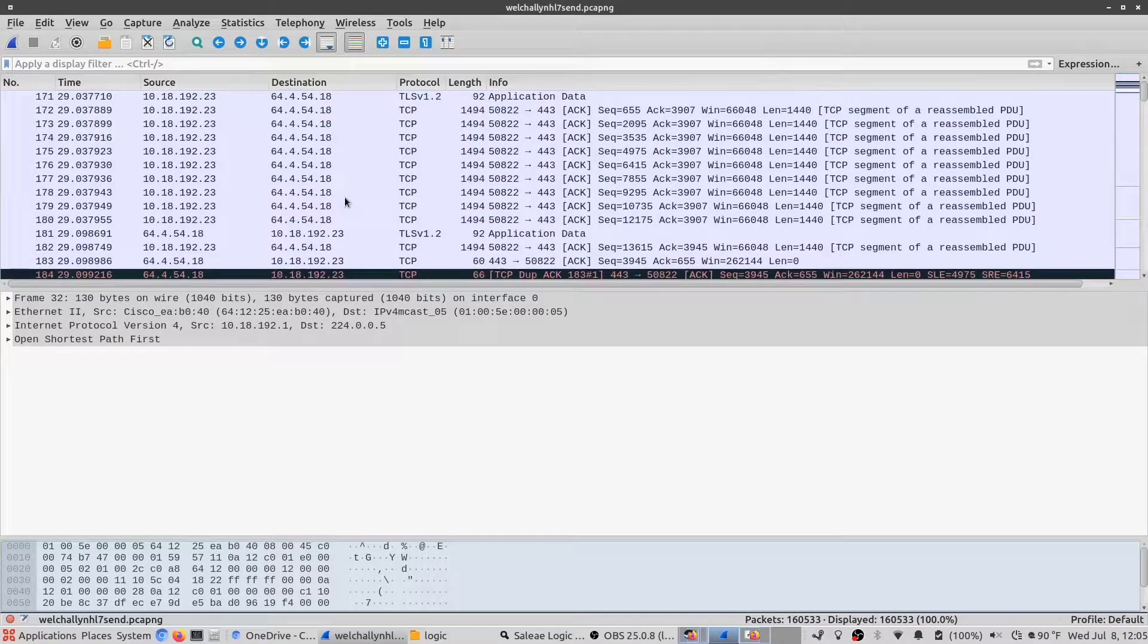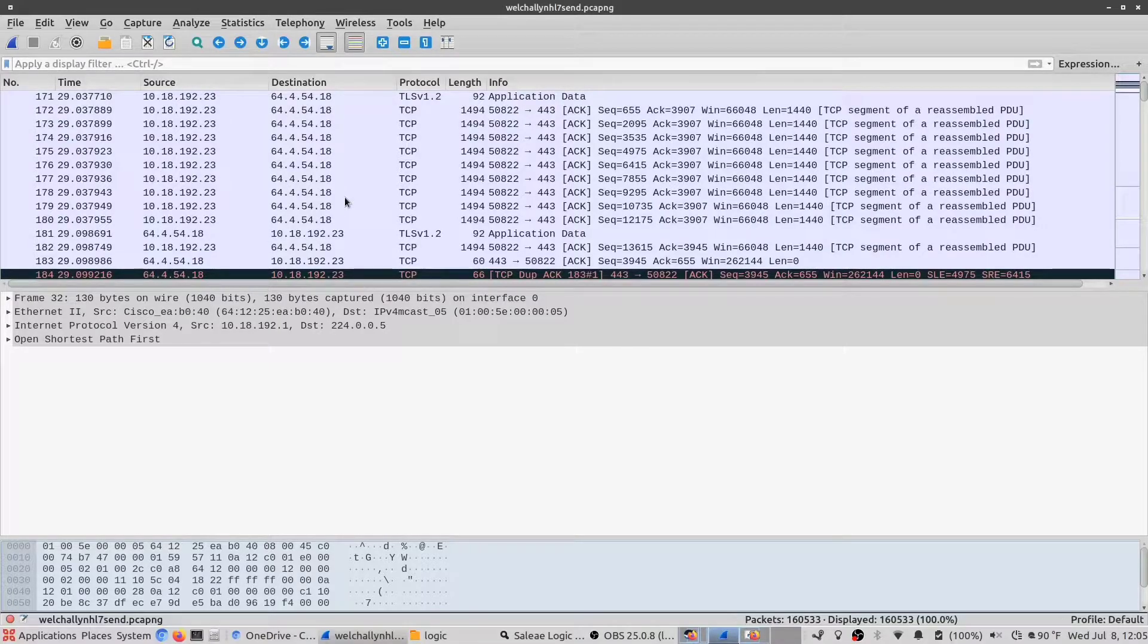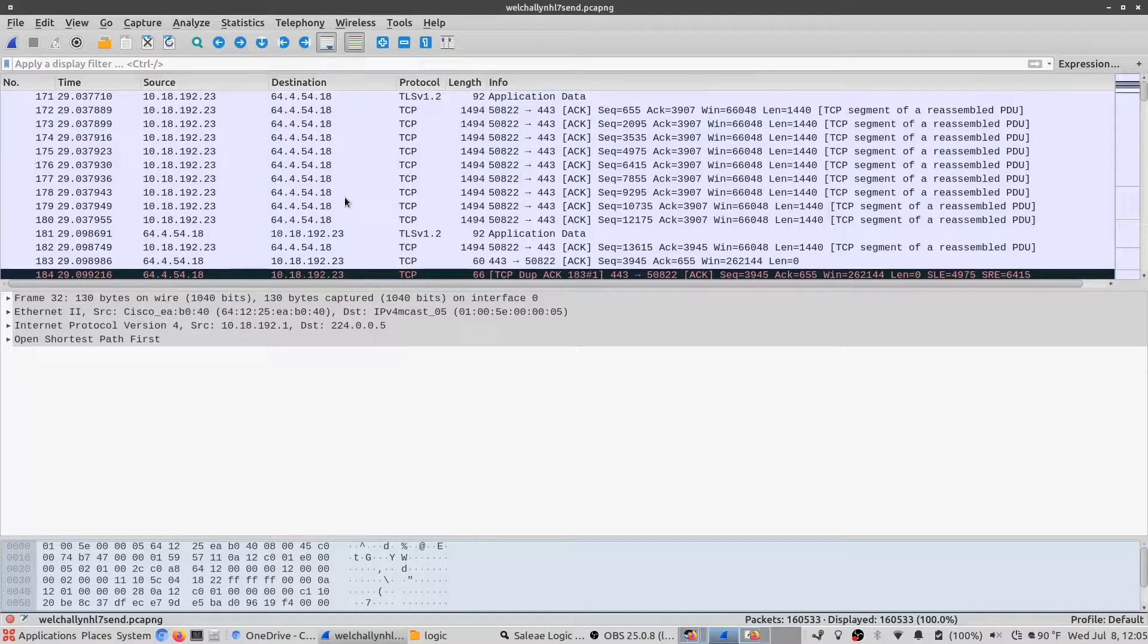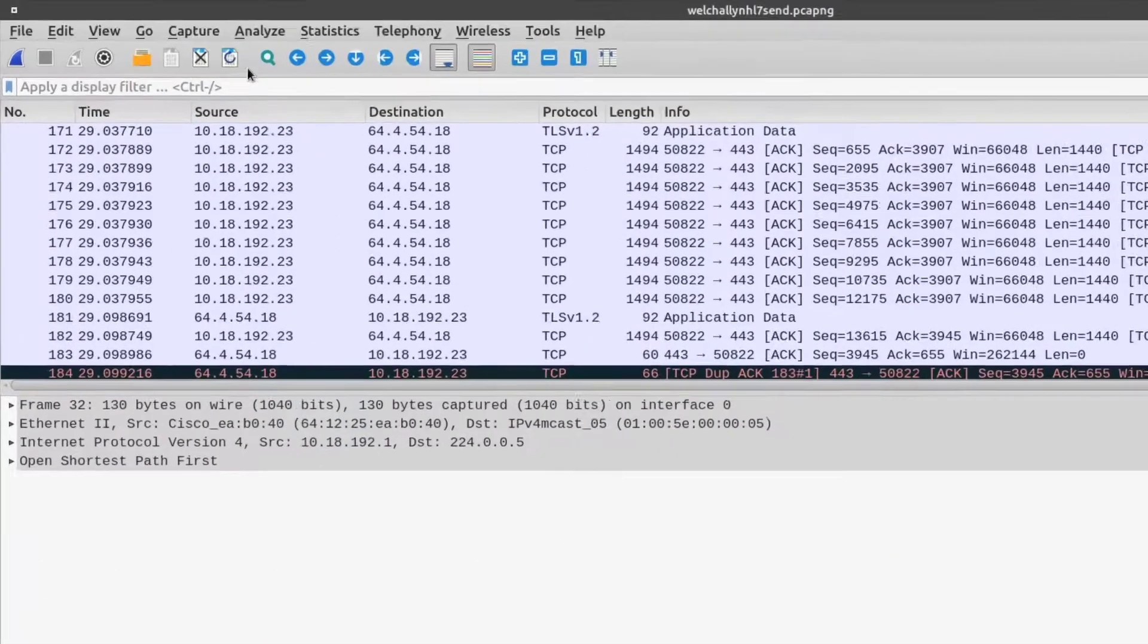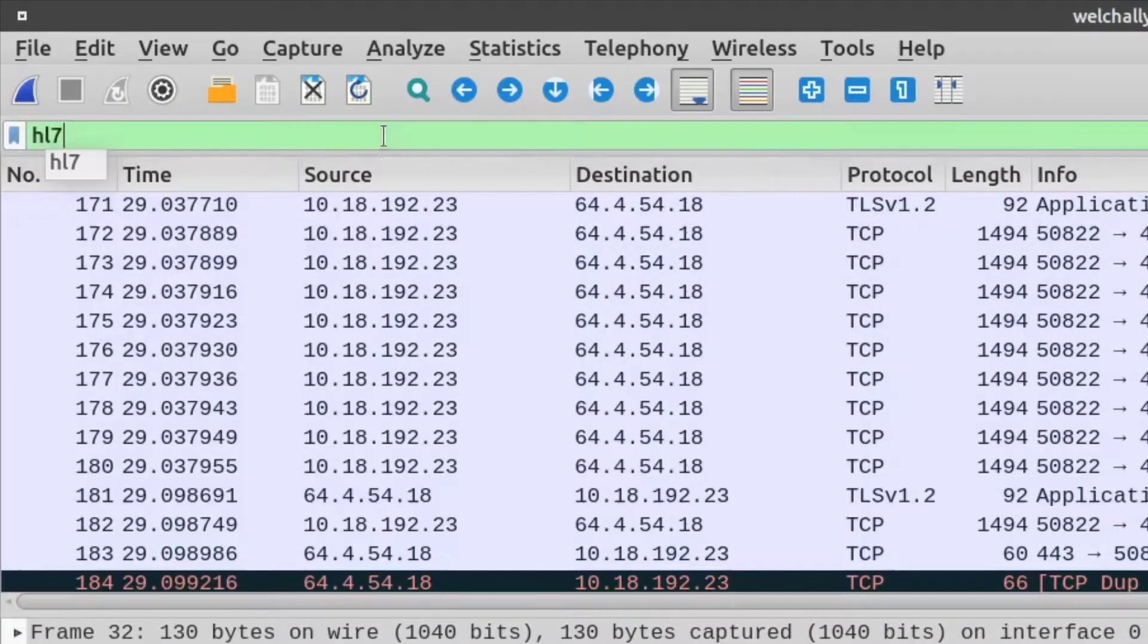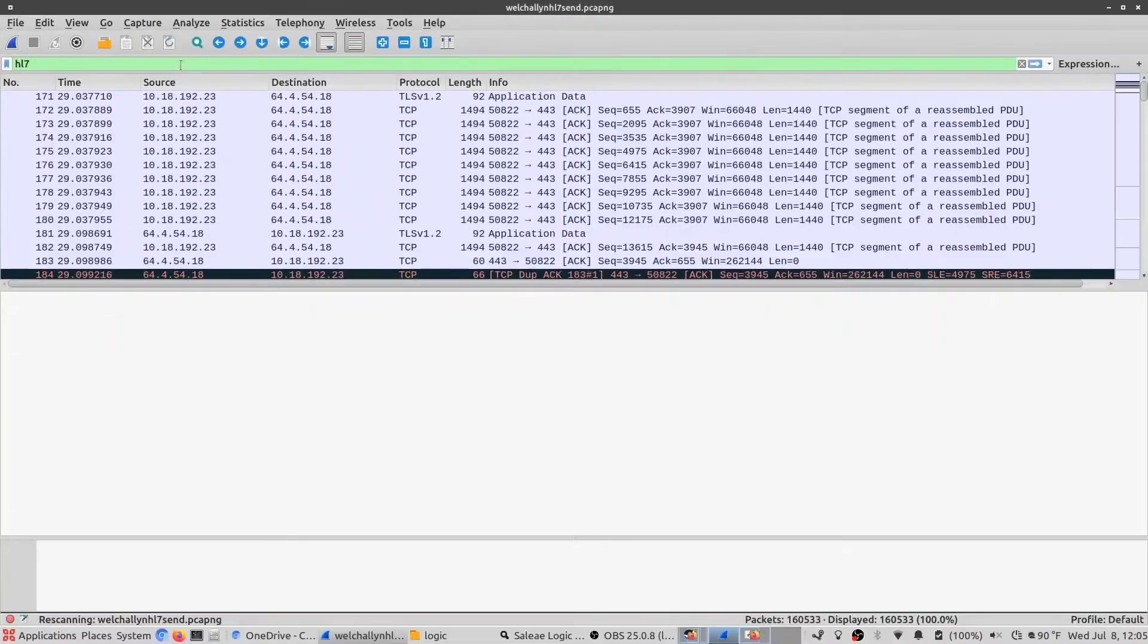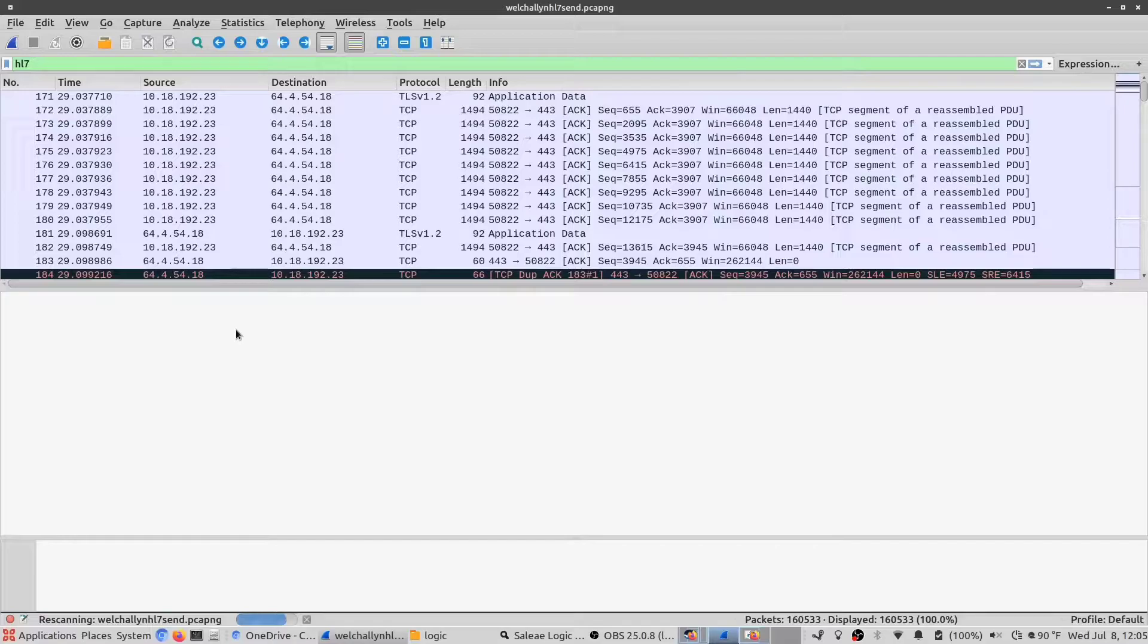We could spend the whole day going through this file looking for the packets we care about, but we know that we're only looking for HL7 packets. So using the filter tab at the top, we can type in HL7 and press enter, and Wireshark will start pulling out all the HL7 packets.